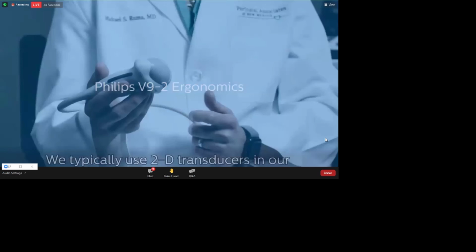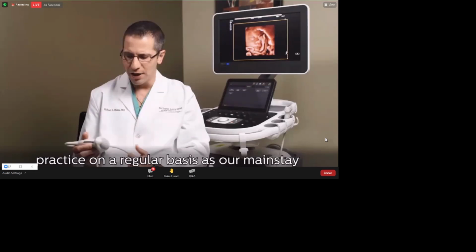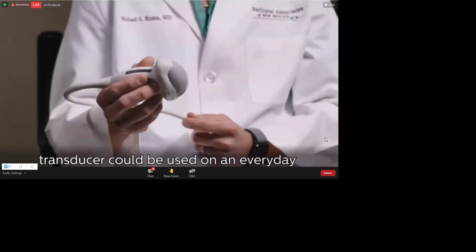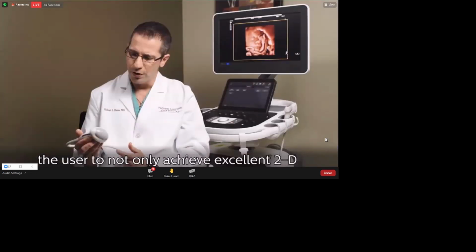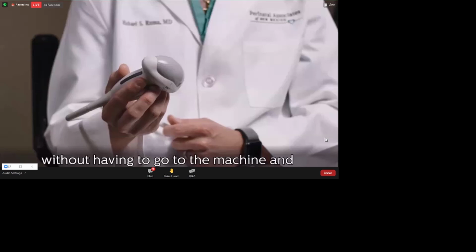We typically use 2D transducers in our practice on a regular basis as our mainstay for 2D imaging. However, the ergonomic design of the V92, I think that this transducer could be used on an everyday basis as a workhorse transducer to allow the user to not only achieve excellent 2D imaging, but also to be able to instantaneously convert to 3D imaging without having to go to the machine and swap out transducers in your hand.